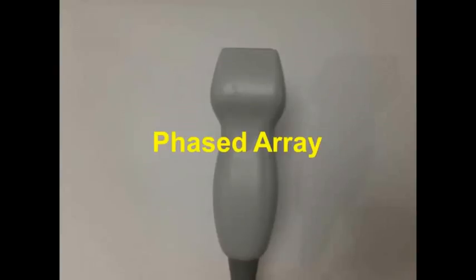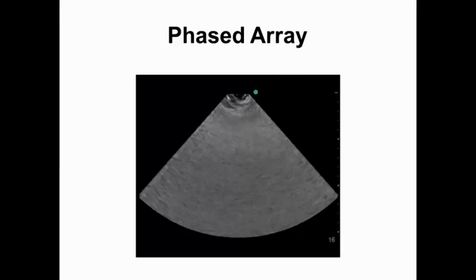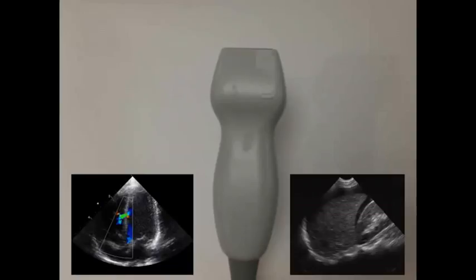Next is the phased array probe, also called the cardiac probe, though it has other uses. This probe also has a relatively linear footprint, but the term phased array means that this probe emits waves from a focal source in an arc that will produce a wedge-shaped image. This is the wedge-shaped image produced by the phased array probe. The small footprint of the phased array probe makes it good at sneaking views in between rib spaces, which is helpful when performing echocardiography and as an alternative to the curvilinear probe for the FAST exam.